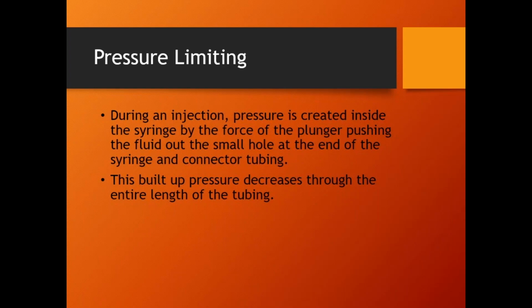All right. Any of the BMEDs, you guys ever worked on infusion pumps? All right. What's the alarm? At what pressure? What psi does a typical one alarm? And you don't have to be exact, but ballpark. What's the maximum pressure we will allow an infusion pump to get to before we shut it off? We start alarming and we get the nurse's attention. Everybody recall? Yeah, I was gonna say it's like 10 to 20 psi.